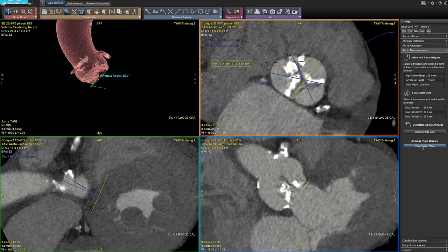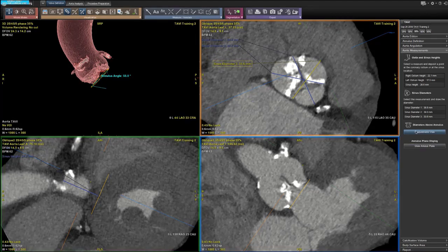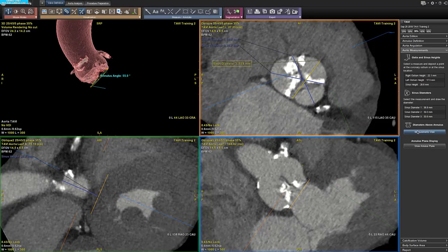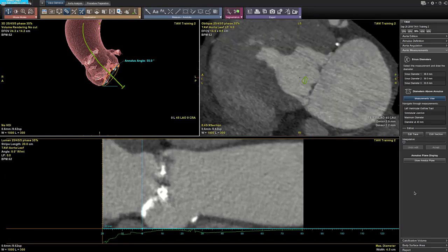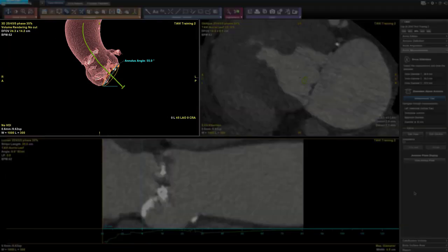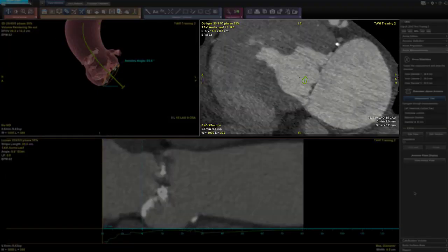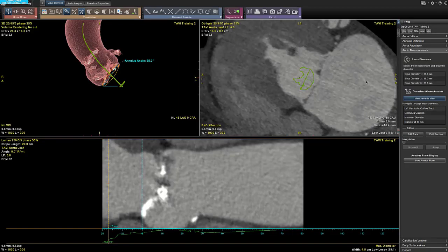To access the diameters above annulus measurement, you click on the measurements view button in the diameters above annulus part. The layout is updated and split in three viewports: one 3D view of the aorta, one cross section view which is an opaque view, and one lumen view.